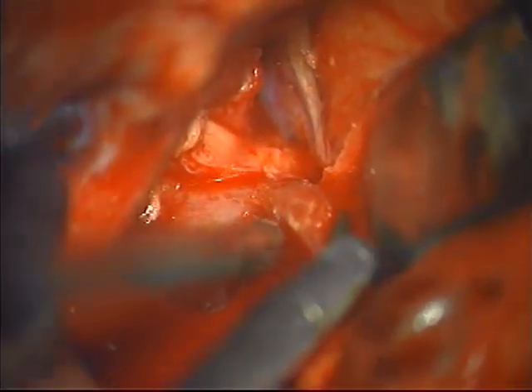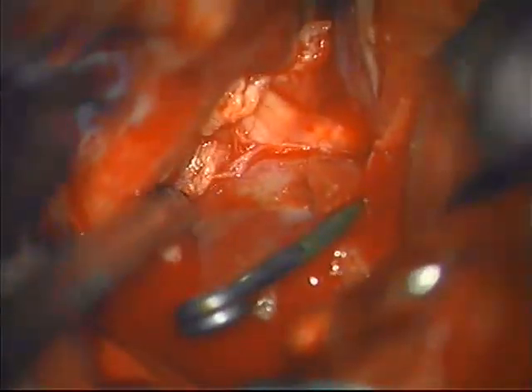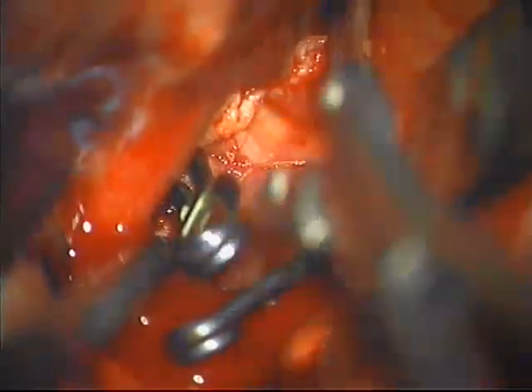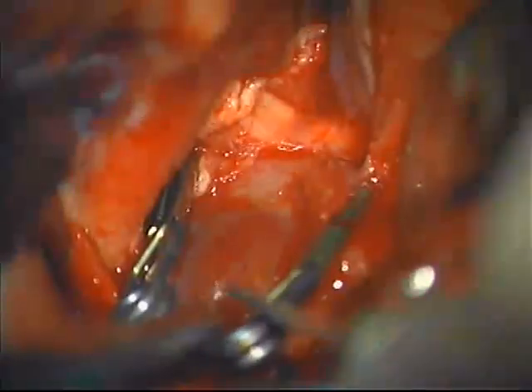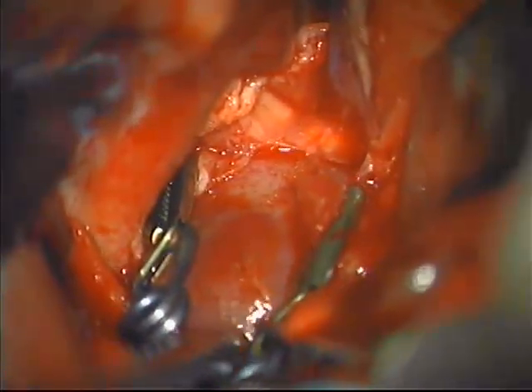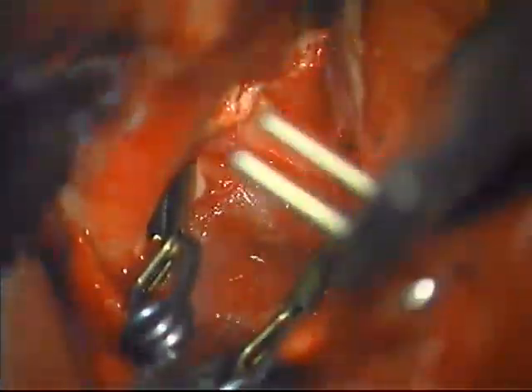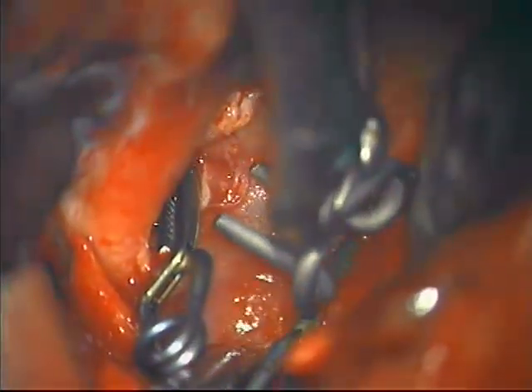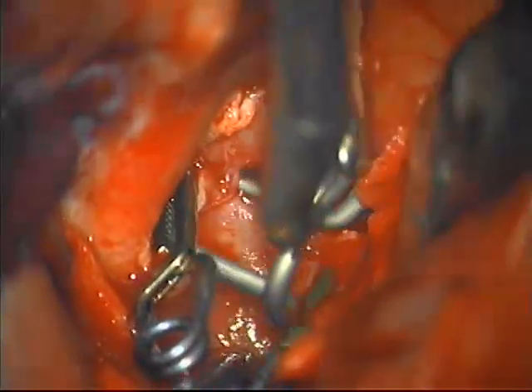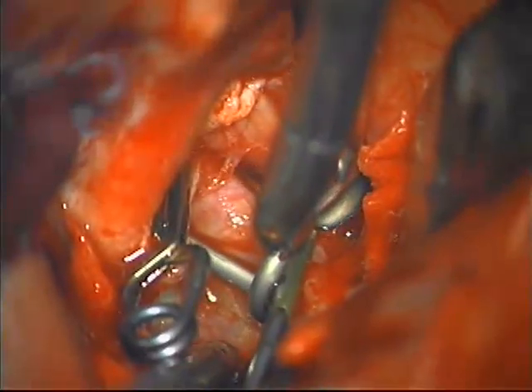We put a temporary clip distal to the neck of the aneurysm, and another temporary clip is positioned between the proximal and distal dural ring. We puncture the dome of the aneurysm and we apply negative pressure to collapse the dome of the aneurysm. Using a series of fenestrated ring clips, we will try to reconstruct the normal trajectory of the internal carotid artery.